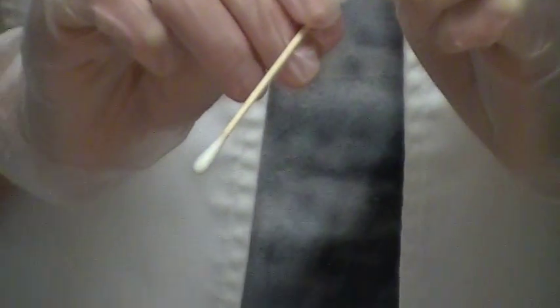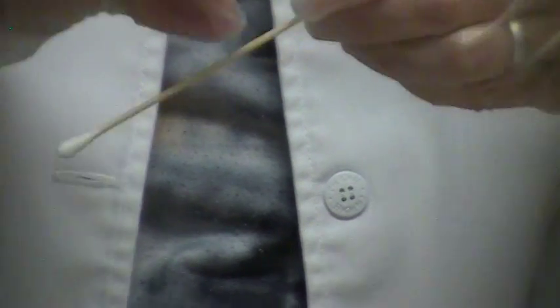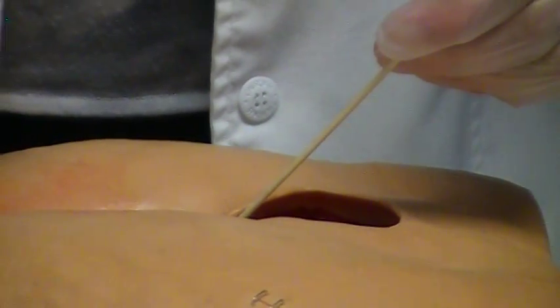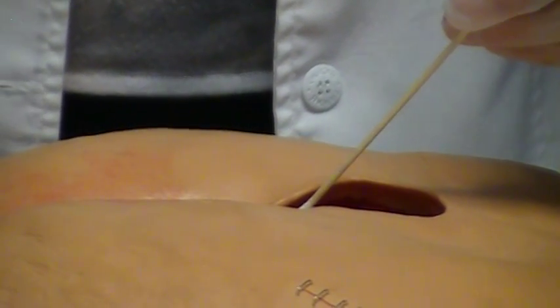Now, if you remember, undermining is basically a lip that's occurring at the edge of the wound. And so you would be able to take a Q-tip and stick it underneath that outer edge of the wound. So if you look here, and once again, once you've touched the inside of this, that's sterile. But if you touch the outside of the wound with your Q-tip, then it becomes non-sterile. You've contaminated it.